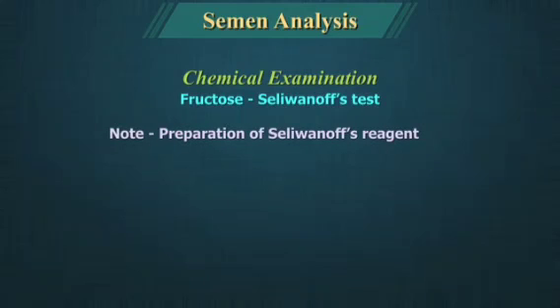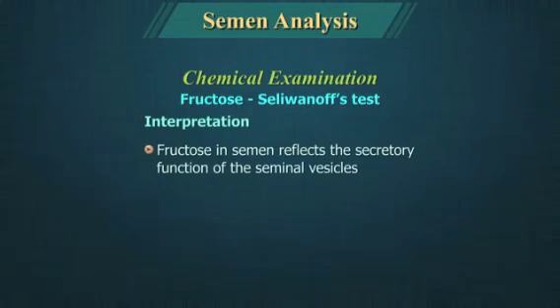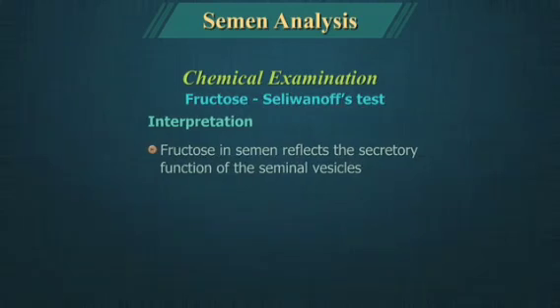Note: for preparation of Seliwanoff's reagent, dissolve 50 milligrams of resorcinol in 33 ml of concentrated hydrochloric acid and make up the volume to 100 ml with distilled water. Fructose in semen reflects the secretory function of the seminal vesicle.